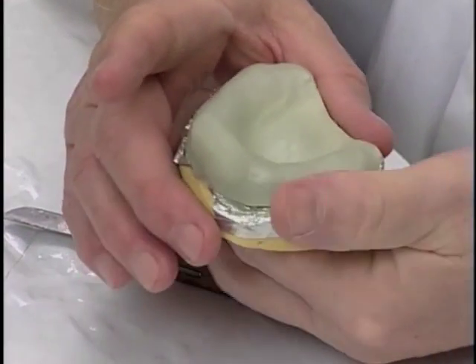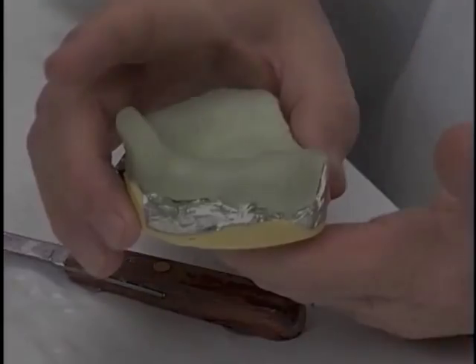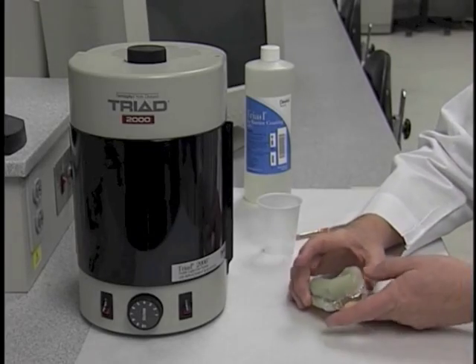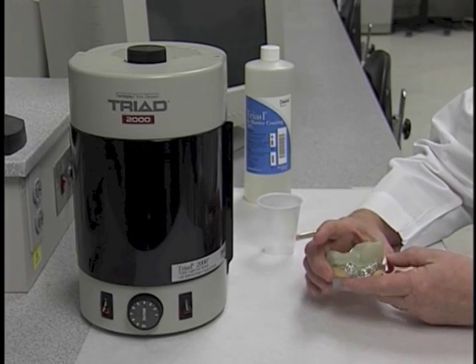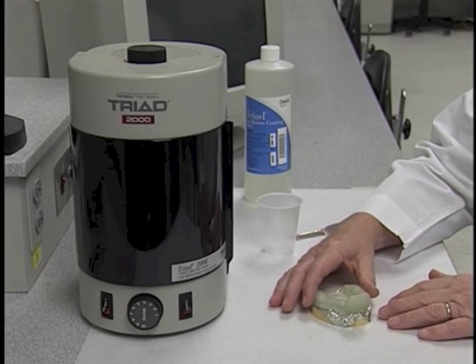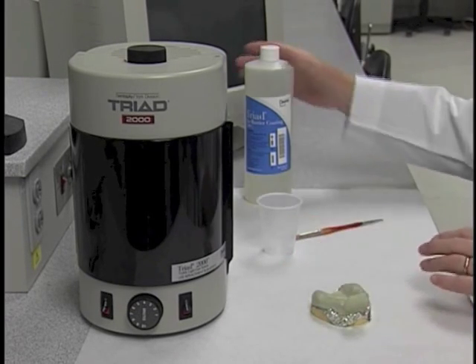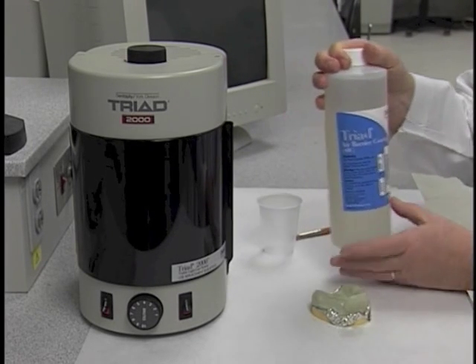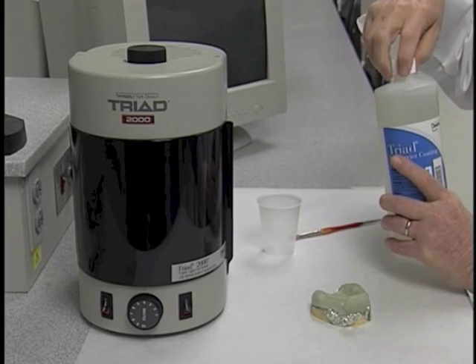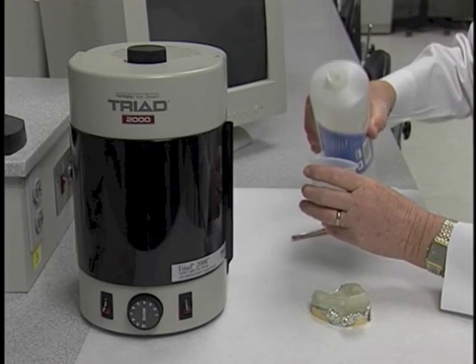the next procedure from there will be to cure it in the Triad unit. Now that we've adapted the material to the cast, we need at this point to paint the outside portion of the material with a coating, which is Triad's air barrier coating. I like to do that by pouring a little of it into a cup so that we don't waste any material.